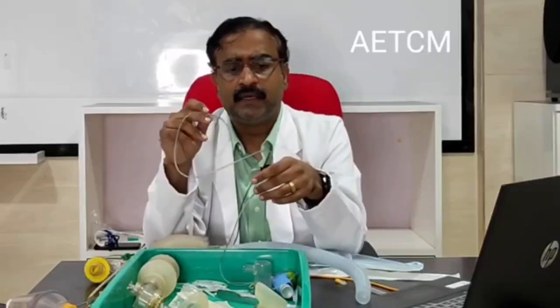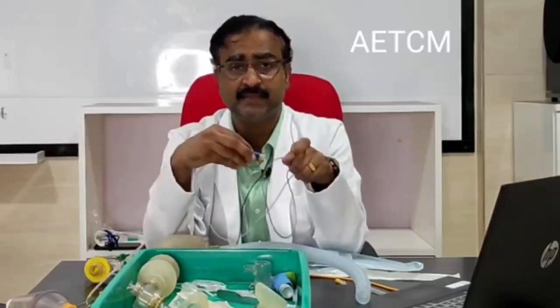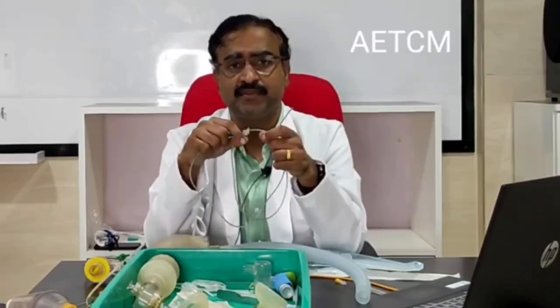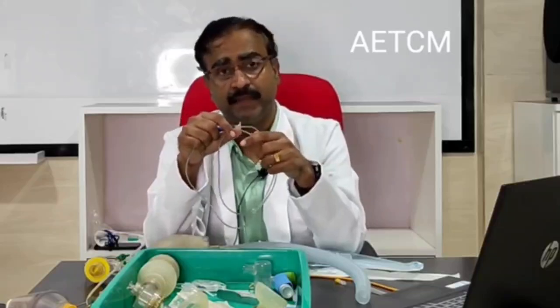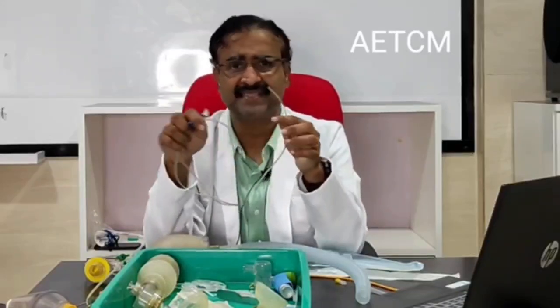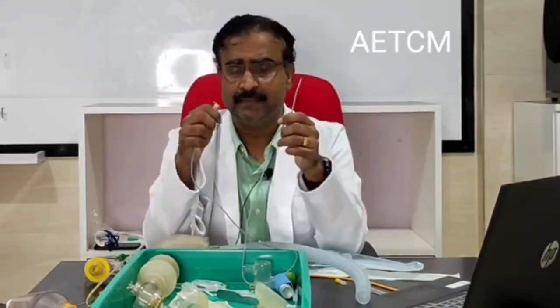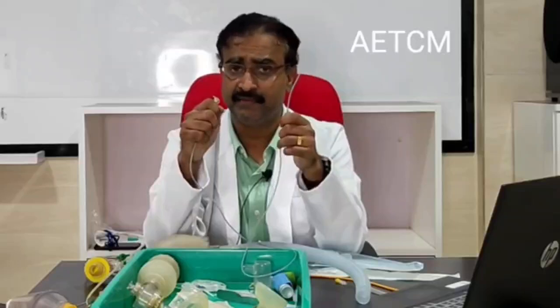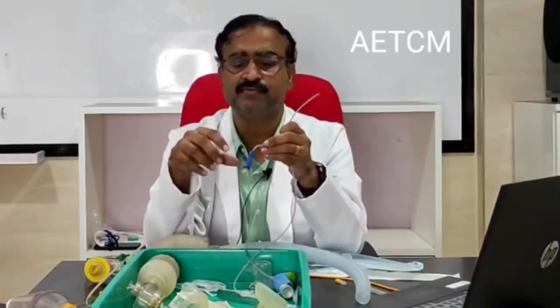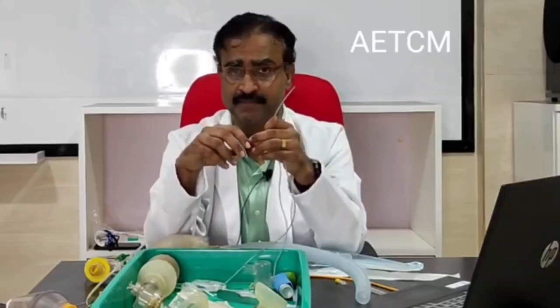Now, how do you confirm that this tube is inside the stomach? Okay, at times the baby may be having coughing and vomiting, and then there is a little unsureness as to whether the tube is inside or it has gone the wrong way. The way to confirm ideally would be to get an X-ray, but an X-ray may take a little longer time. So you aspirate. Usually you do get the stomach contents, but at times if you get a frothy fluid, you are going to be confused. So what you can do is put the end in a bowl of water and see if it continues to bubble with the respiration, that means you are in the wrong way. You need to reposition. Okay.